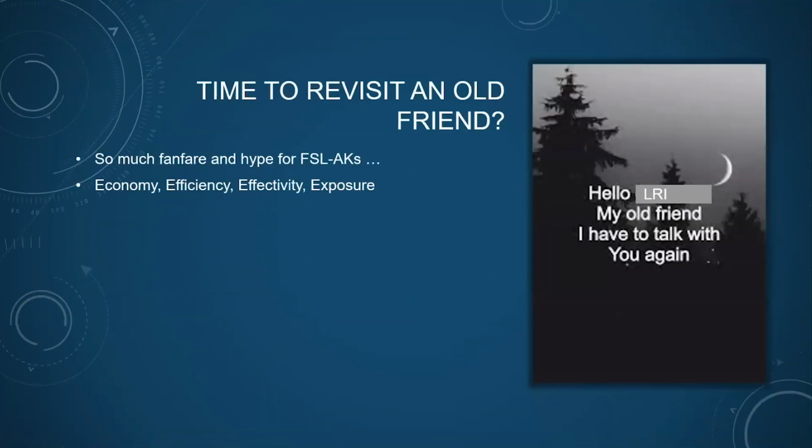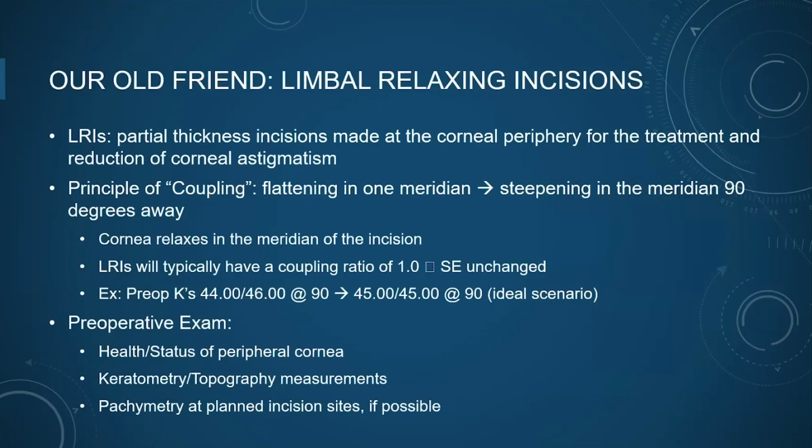And so maybe we have to realize that there was so much fanfare and hype for femtosecond AKs, when really the good old LRIs have economy, efficiency, effectivity, and less exposure to problems caused by irregular astigmatism and perforations that have been reported quite extensively in the literature with femtosecond laser AKs as well.